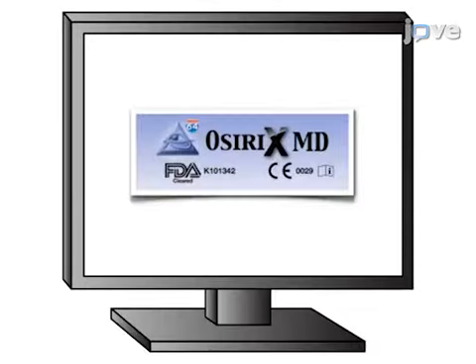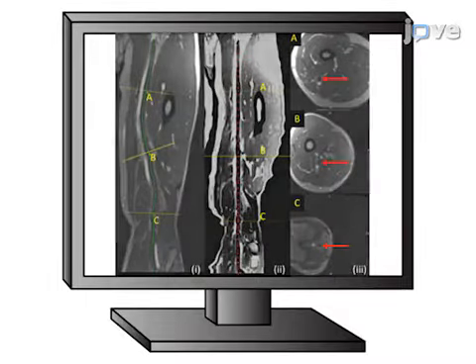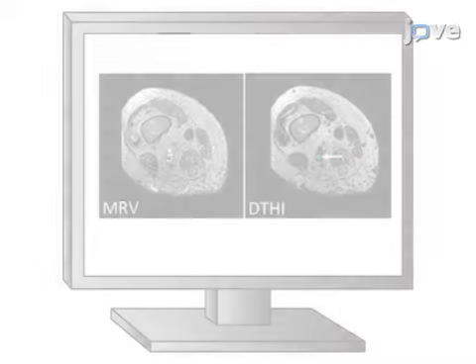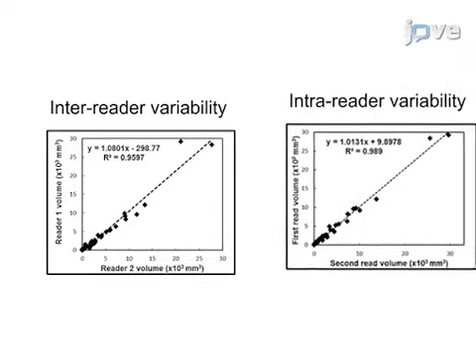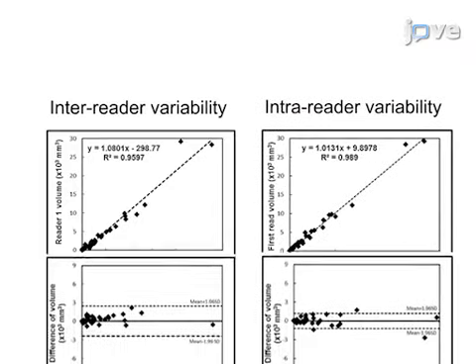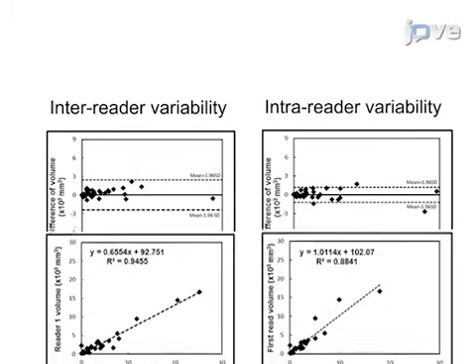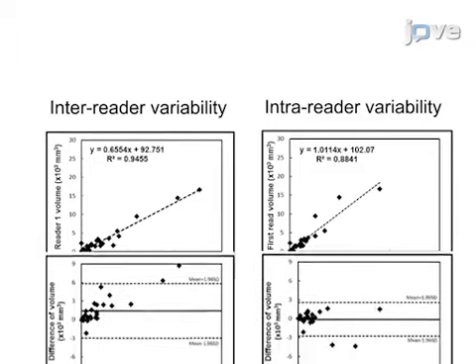After images are acquired at various imaging centers, they are transferred to a dedicated central core laboratory for analysis. The results show that this approach for imaging deep vein thrombosis is feasible, robust, and reliable, with excellent inter- and intra-observer reproducibility and minimal bias between two separate observers.